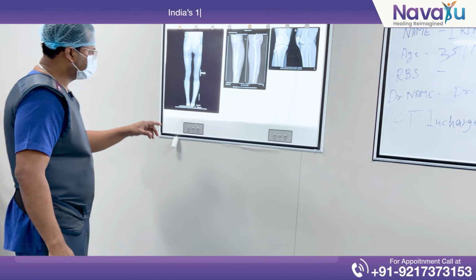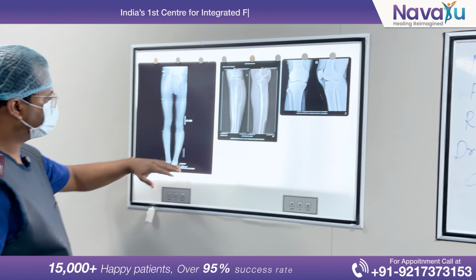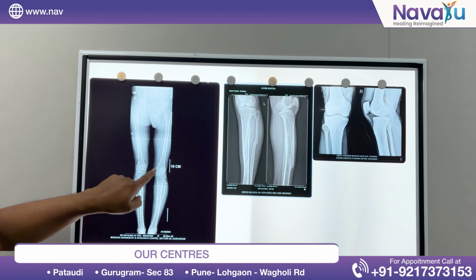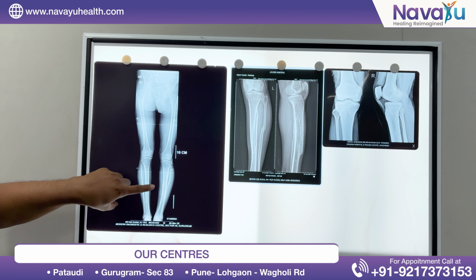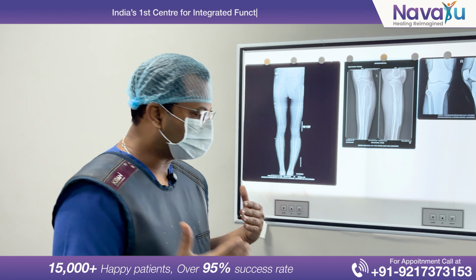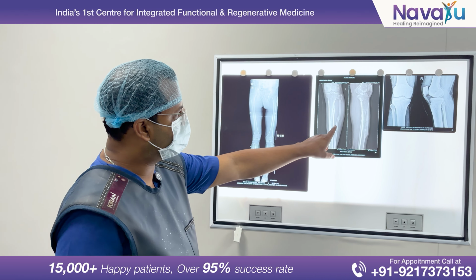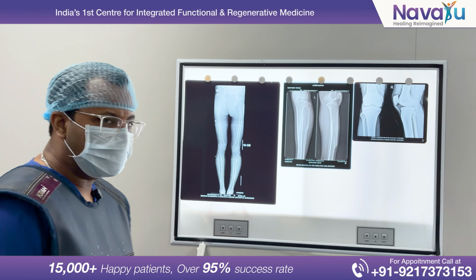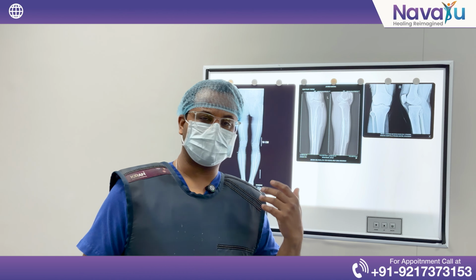If you see this case, this is the right side, then the left side, and this is the scanogram. In the scanogram, you can very well judge that there is a deformity in the left side because of an old fracture. It is malunited, means the fracture is not united correctly. The alignment is totally wrong. Because of that, the fibula is totally out and it is leading to a varus deformity. Because of this varus deformity, the patient also has shortening.